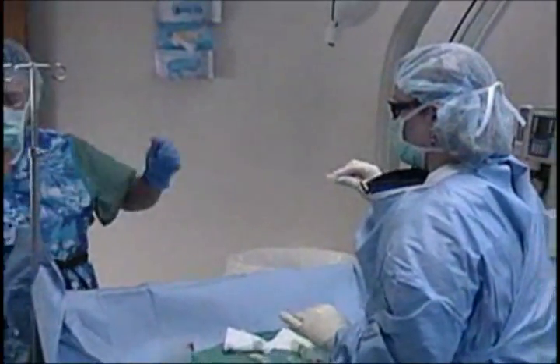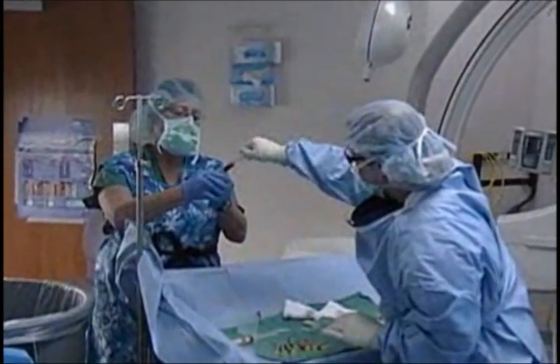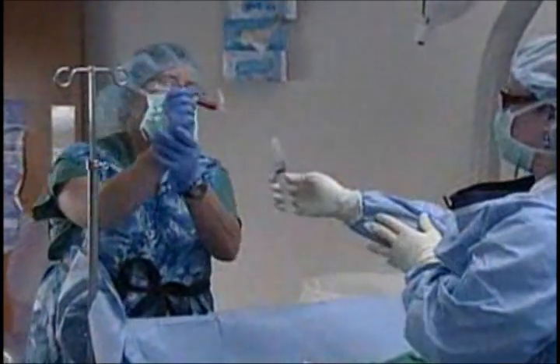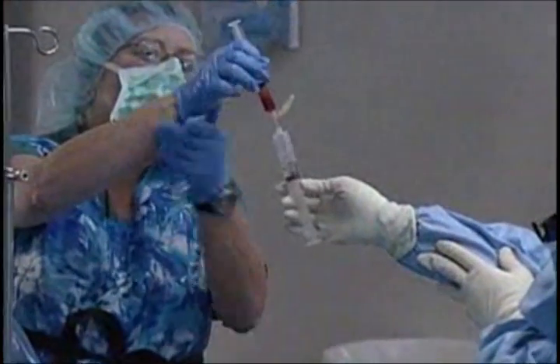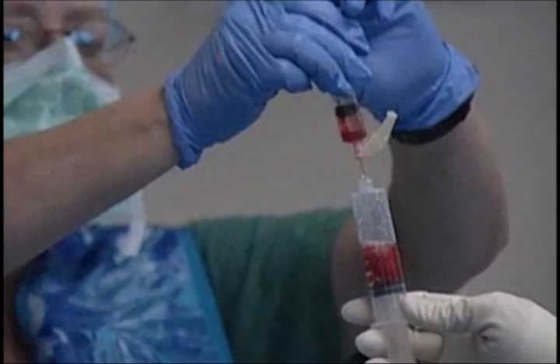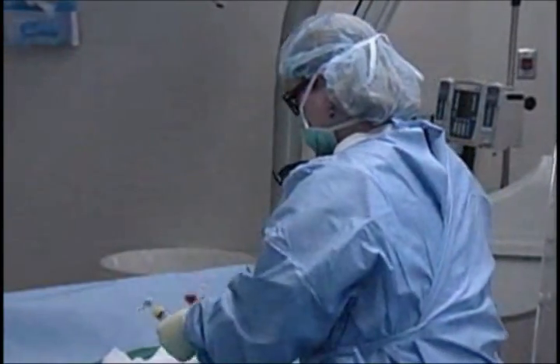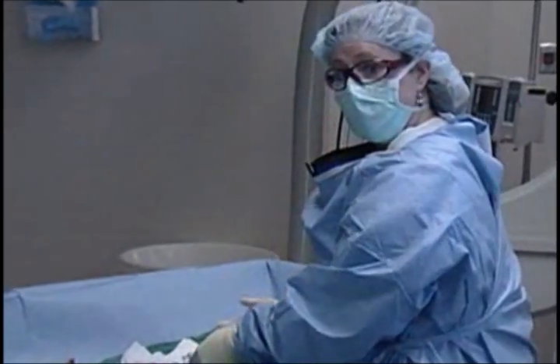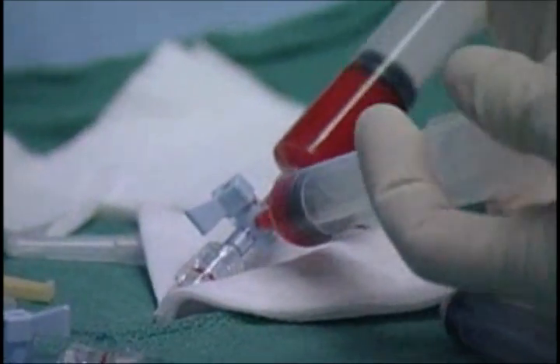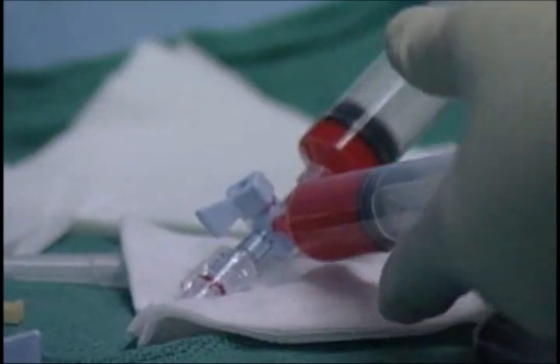The doxorubicin will be next, which is red — again 50 milligrams. For hepatocellular carcinoma I typically use 50 milligrams of each of these drugs. One could use 100 milligrams of either drug or a 50 milligram dose of either drug, but I think it's beneficial to combine them both. These agents will then be mixed via a stopcock to get them thoroughly and evenly distributed in the solution. You have to do this fairly expeditiously because the ethiodol will degrade plastic stopcocks and start to leak, and then you would lose some of the drugs.